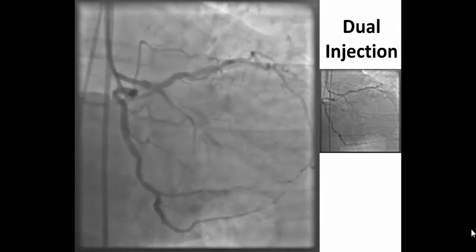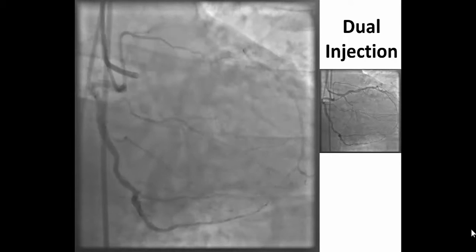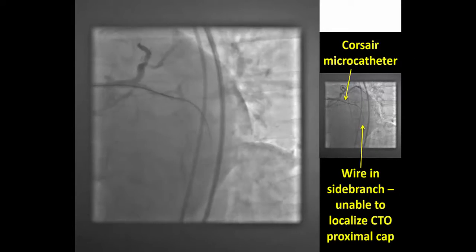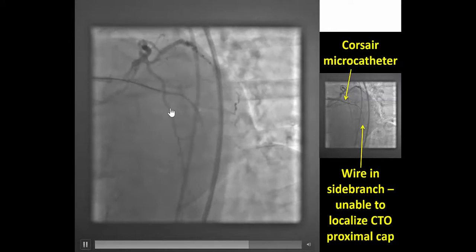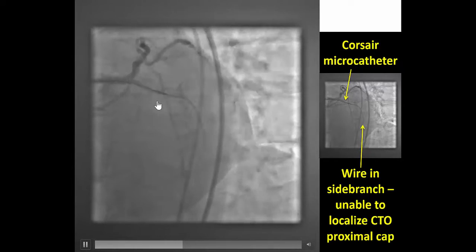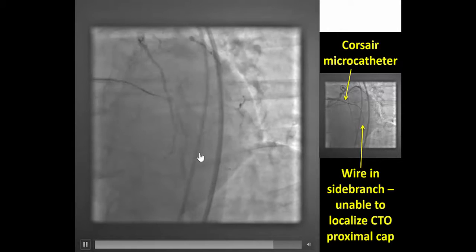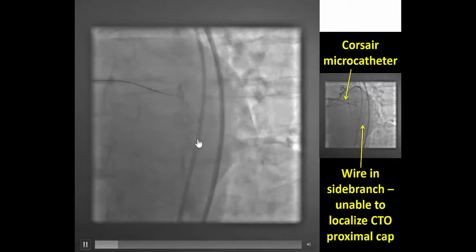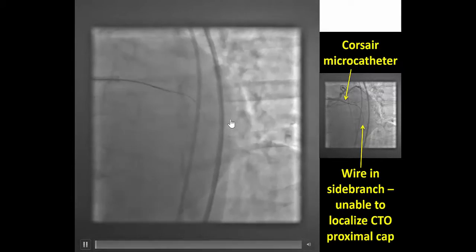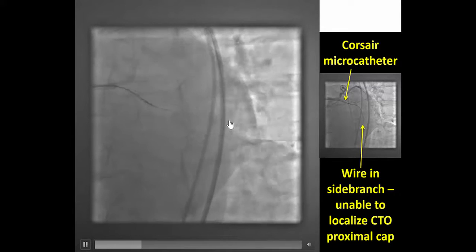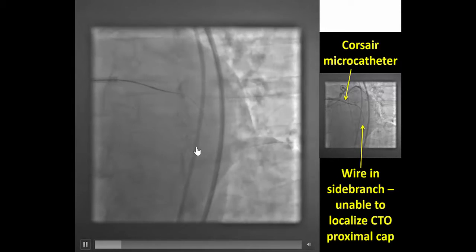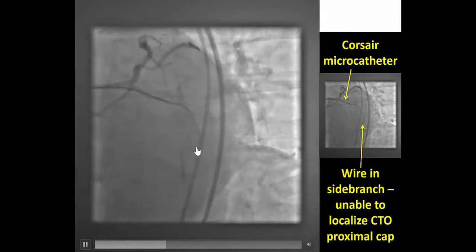Our plan here was antegrade crossing with various techniques to clarify the proximal cap ambiguity. We advanced a Corsair microcatheter and performed antegrade wire escalation. However, the guide wire, as can be appreciated here, is not moving in sync with the distal target vessel. Instead, it tended to track into the side branch, which is the distal circumflex.